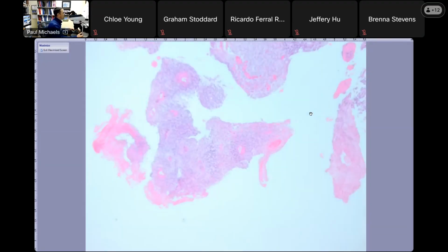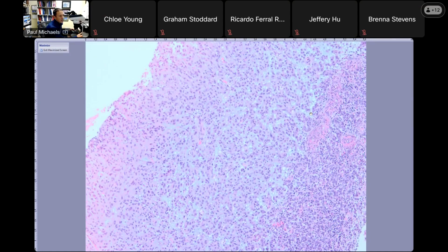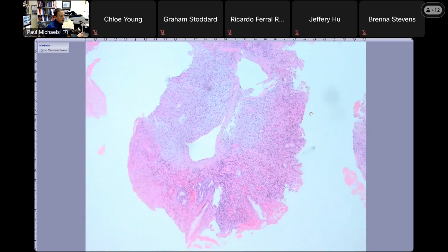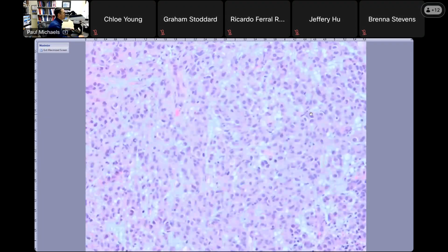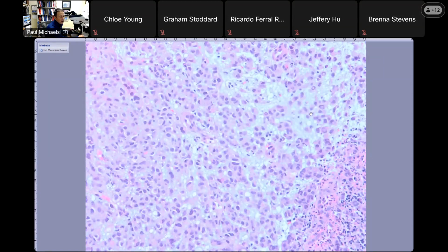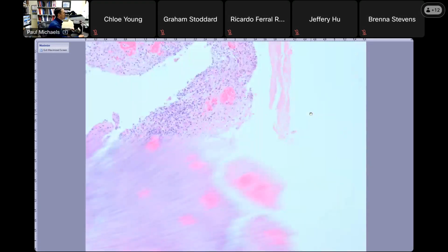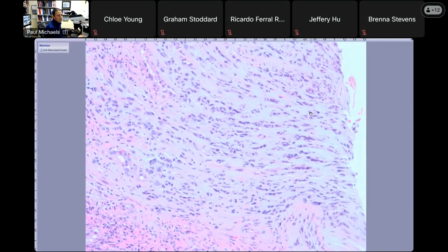Here's one that a colleague showed me in Austin, and said, hey, you agree this is a signet ring cell, diffuse type stomach cancer. This was a biopsy in a person with an ulcerated stomach mass. You can see there's a little hemorrhagic, ischemic looking gastric mucosa. And then you have this myxoid, epithelioid single cell. This looks like either a diffuse type gastric carcinoma or what else? Lobular carcinoma, which often goes to the stomach, really looks like this. But the stroma, to me, I thought it was myxoid, not desmoplastic. And the tip-off when he showed me this case is this looked a little more spindled. And I'm like, I bet this is a GIST. This is a PDGFRA mutated GIST. And that's exactly what it was.